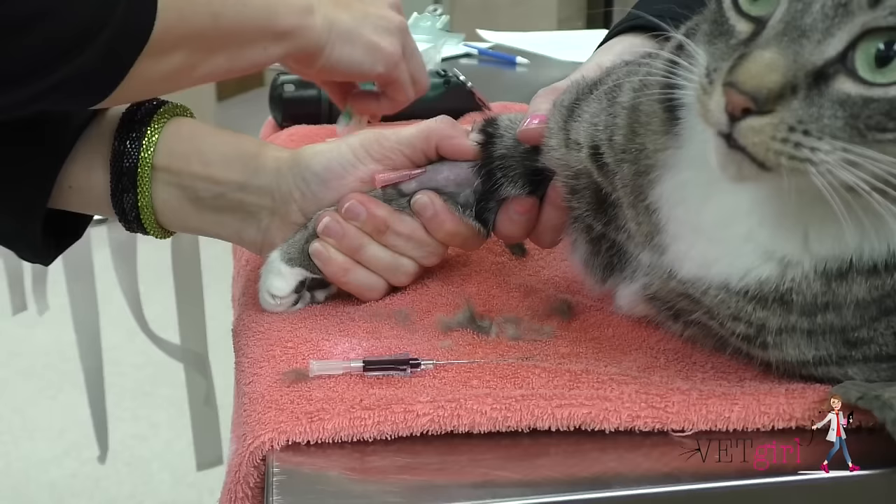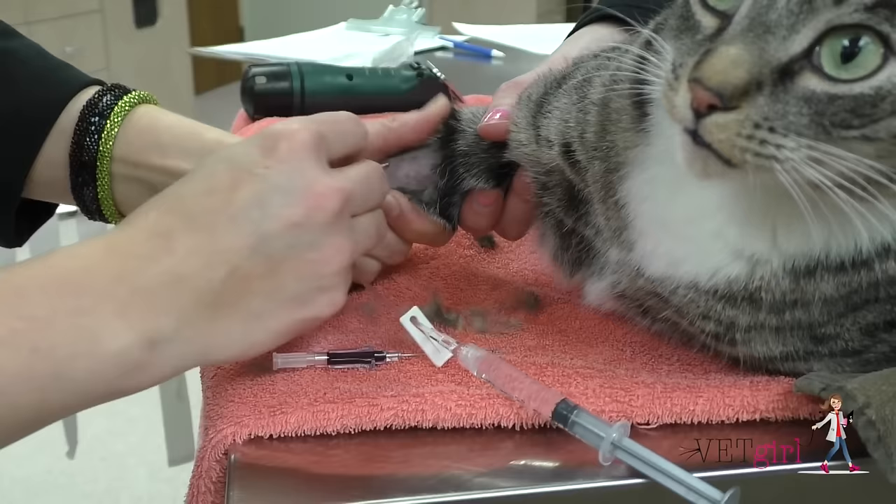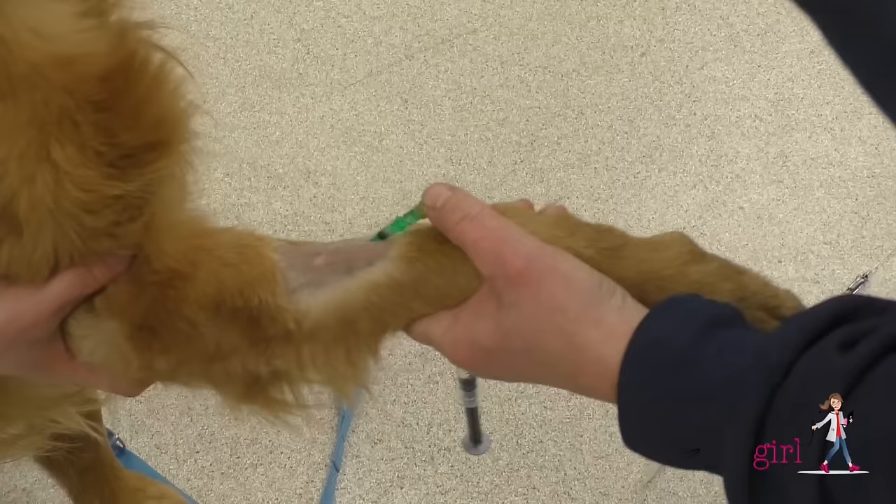Once the catheter is thought to be seated within the vein, the catheter should be inserted over the stylet, typically with the forefinger, without moving the location of the stylet.